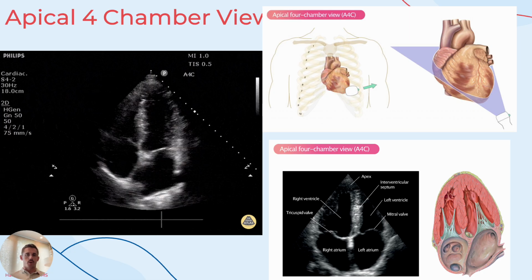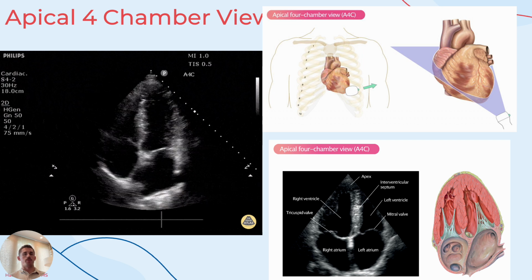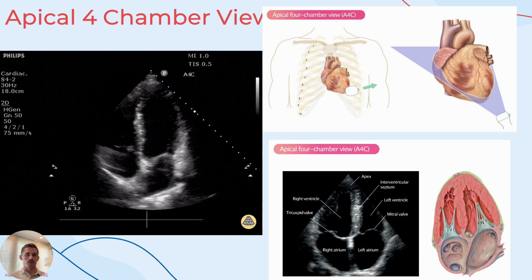Moving on to our apical views, the 4-chamber view is the most widely used screening tool to detect structural cardiac abnormalities during routine fetal ultrasonography. Looking at adults, we're getting a lot of our images from maybe our parasternal long view, our apical 5-chamber view, but in looking for fetal abnormalities, someone would be using the apical 4-chamber view.